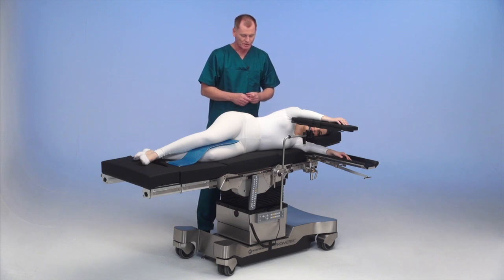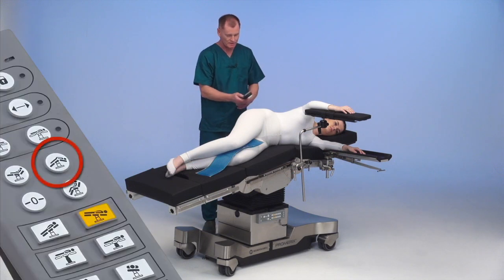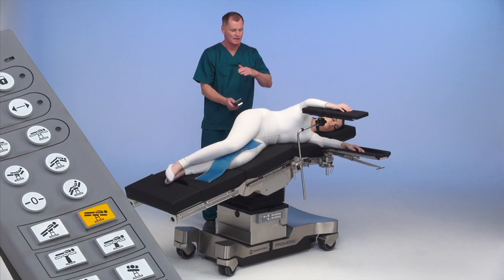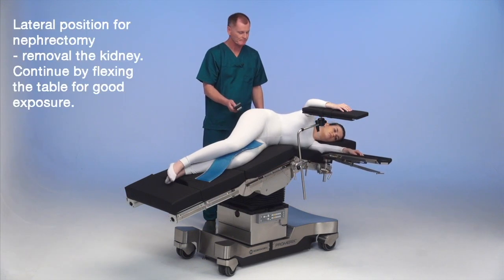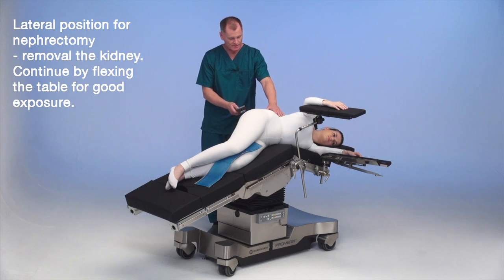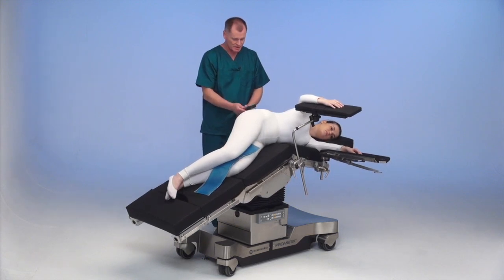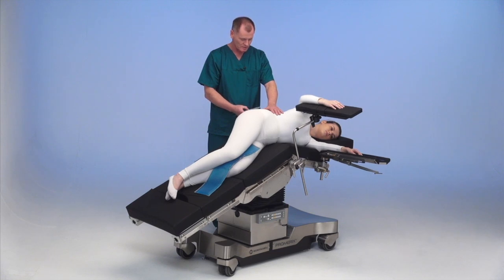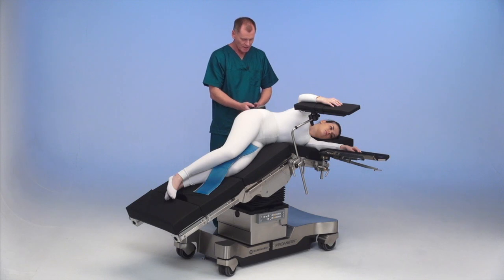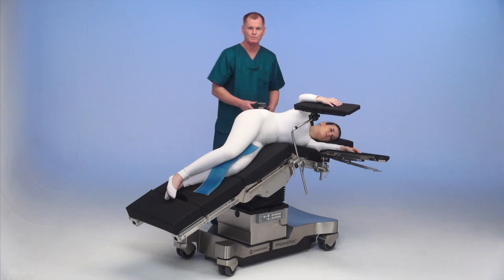To do a nephrectomy, we are going to flex the patient into the kidney position via the hand control. Via the kidney flex button, we can flex the patient in increments to the flex position for nephrectomy. The table safely flexes her into position. You can add reverse Trendelenburg, adjust the table for lateral tilt, and get additional flex via the back down position. This gives you good exposure for removal of the kidney.